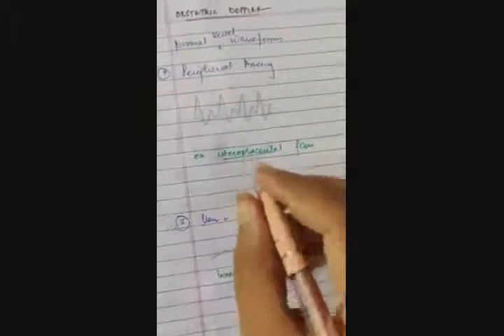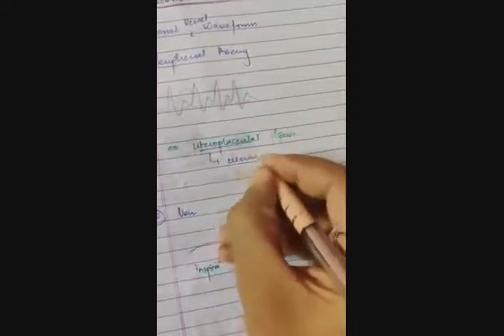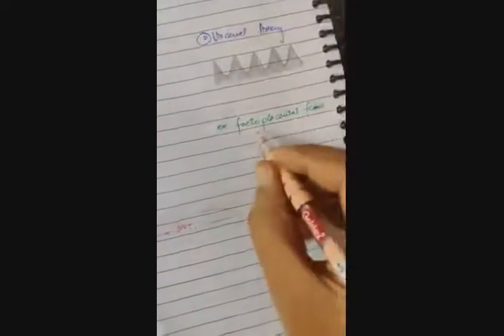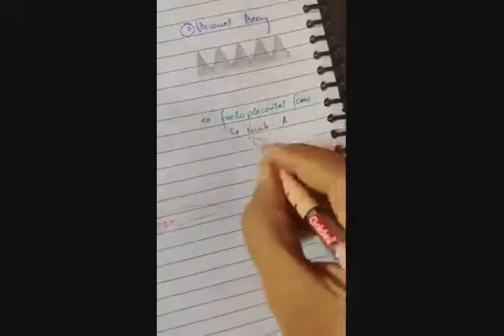The example is uteroplacental flow, which means uterine artery basically. All right. Similarly, when we talk about a visceral artery, it's the artery to the kidney, to the heart. In our case, fetoplacental flow, which means umbilical artery. It even includes ductus venosus.